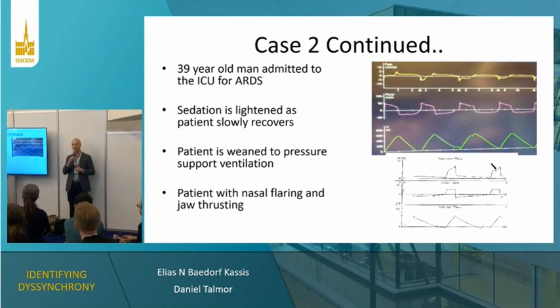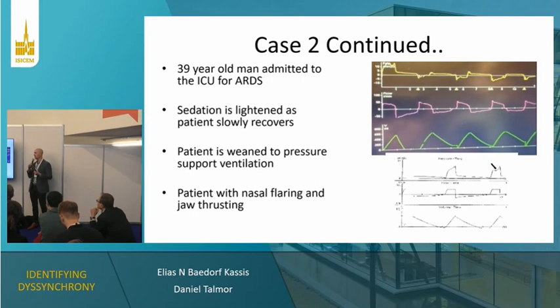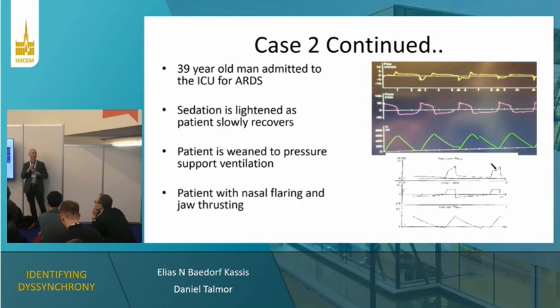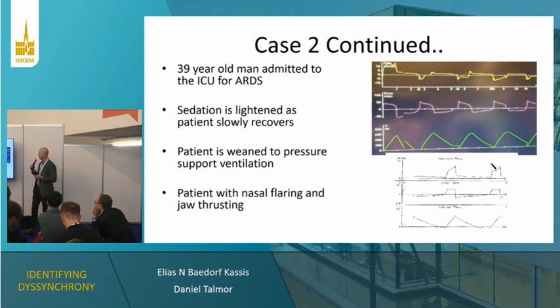from the eccentric contractions that occur. So my personal belief is that we probably can ignore it in less sick patients and then really, really suppress it in our sickest patients to prevent lung injury. But the truth is we don't really know yet how injurious reverse triggering actually is, and it's probably variable, like so many other things, depending on the individual patient.